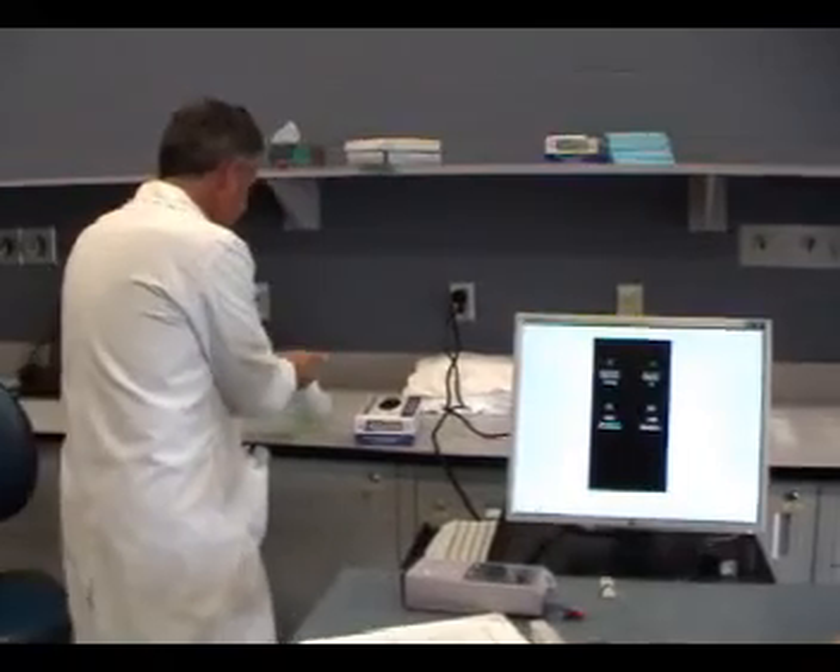So I'm just going to wash my hands here. I've already looked at your chart — you're just in here. You had a bit of pneumonia, and you're just recovering from that? Yeah. I'm just getting — I'm hoping to go home. Well, we'll see how well you're going to do on room air. I've got everything I need right here.